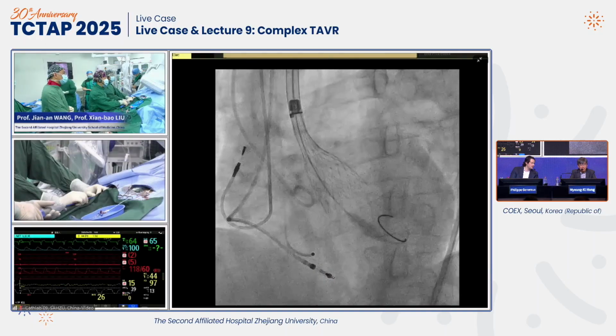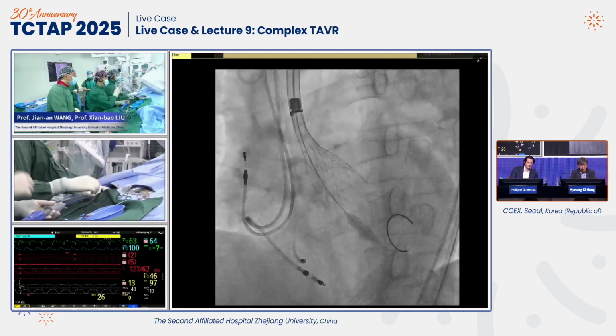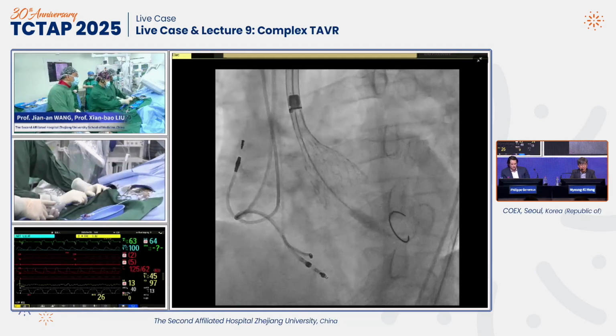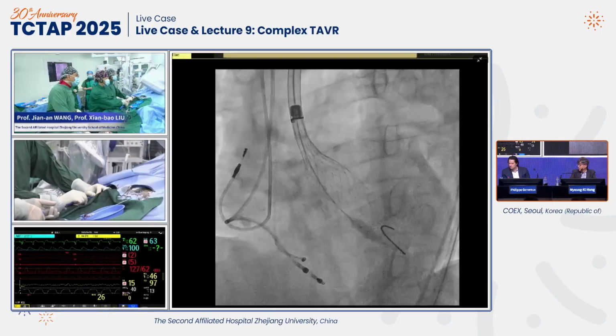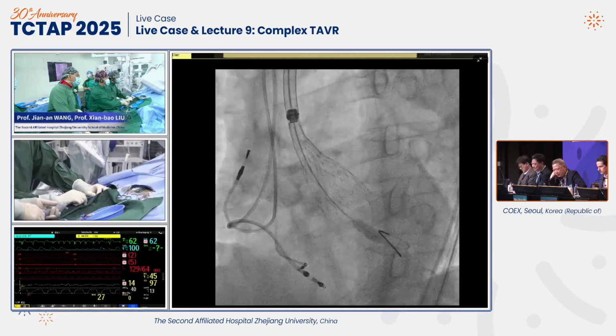Fully agree. And the patient is young, maybe the coronary will be easier to access. Not that it's an issue. You have a very high probability of needing post dilatation. So I think this result is okay.